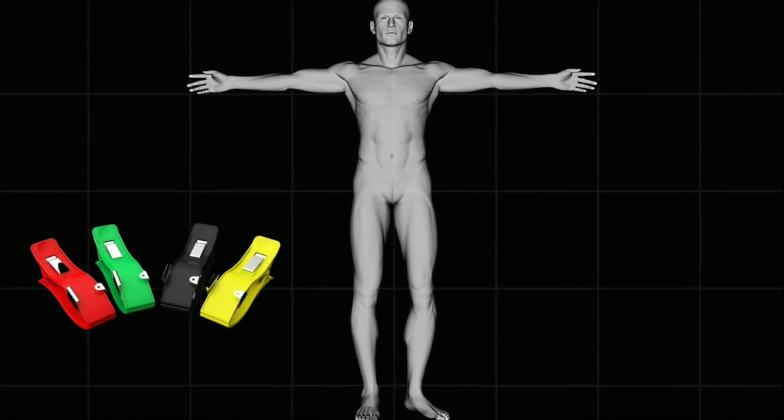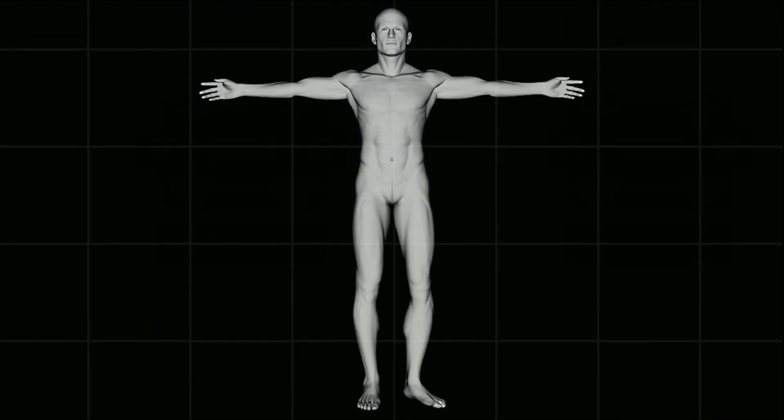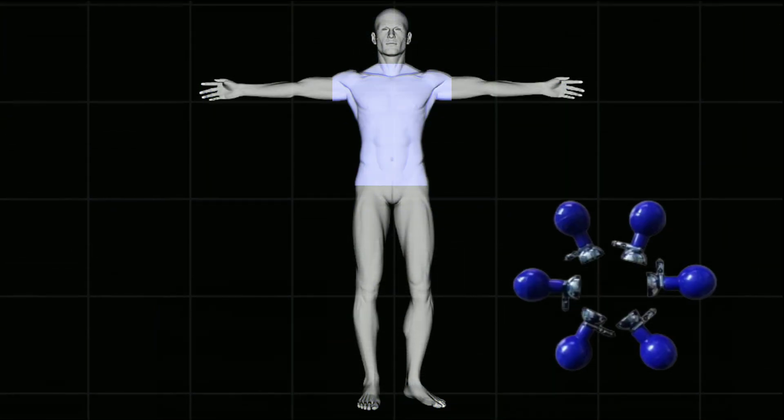Out of these 10, the limb leads are attached on the limbs and the other 6 leads are attached on the chest.